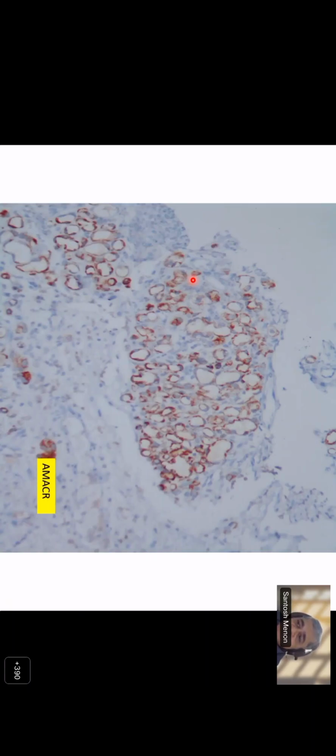We did AMACR. Now you should ask me why I did AMACR. Prostatic, sir. So you should think. Like I said in my last lecture, AMACR is not to be equated with prostate cancer. AMACR doesn't make it prostate cancer. You have to have absence of basal markers. He's a 55-year-old male. He can definitely have a prostate cancer. So my point is, when you have an unusual morphology in any organ, you should think of whether it is a tumor coming from the adjacent organs. That's the thought process. Fine.